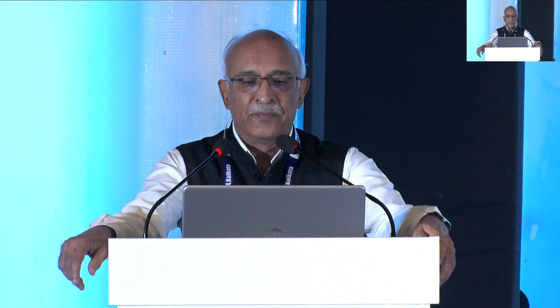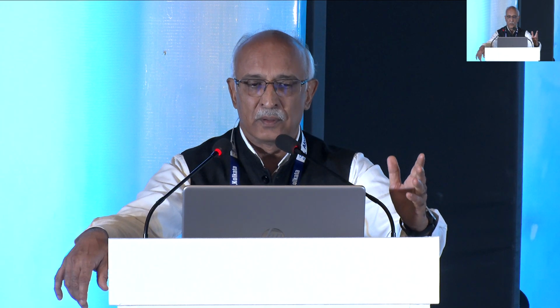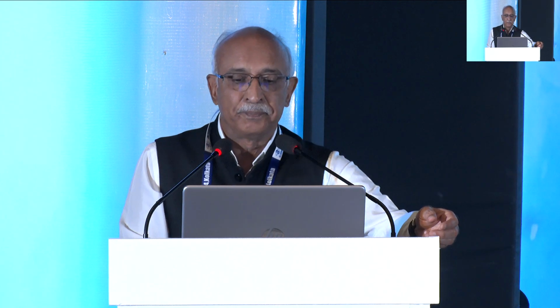So what actually the lesion was, the video is not playing, can you help me? Yeah, it's playing now. This is an old video, and that is why we have a limited field there, a 30-degree field. Actually, it was not a chorioretinitis scar, it was an encapsulated foreign body, and you can see it was right at the macula in a capsule, which later got absorbed, and the patient recovered vision from 3/60 to 6/18 by 2 months, which is very, very heartening.